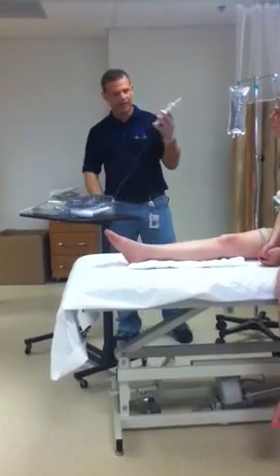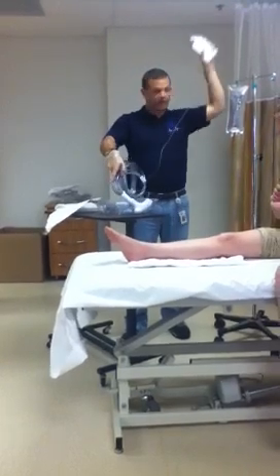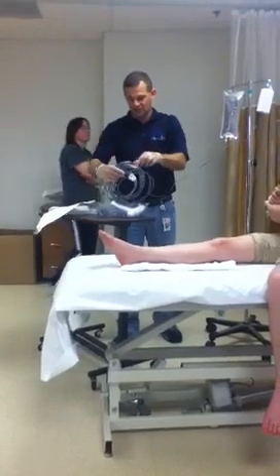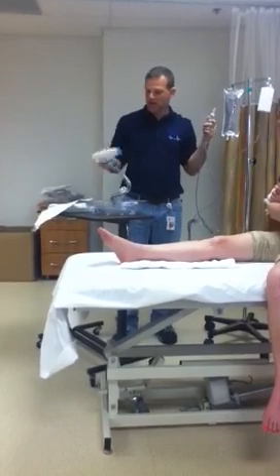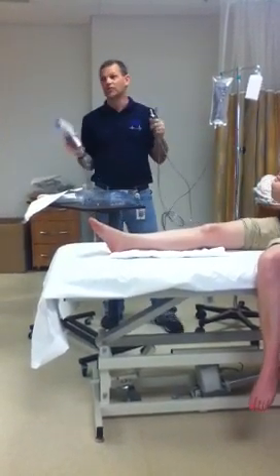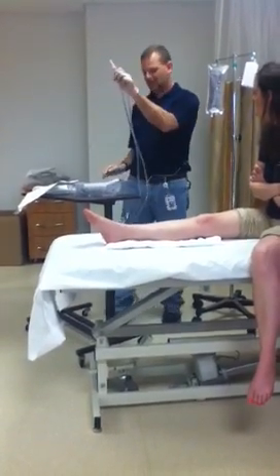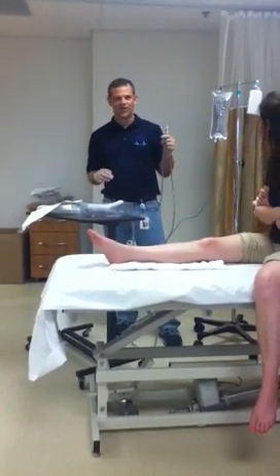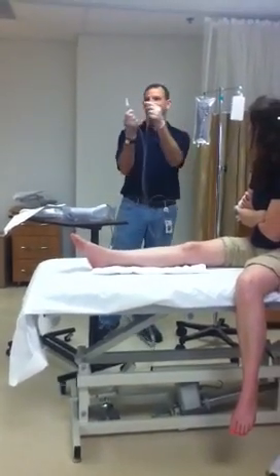I start getting stuff out of here. As soon as I start touching these things, whatever I'm touching is not sterile anymore, but some of it needs to be and some of it doesn't. That doesn't necessarily need to be sterile — that's my battery pack. I'm going to have to be touching this, so it's not going to matter. When I pull this out of the bag, it's not going to have water in it. Now I have two ends to this: one's going to go to my suction and one's going to go to my saline bag.